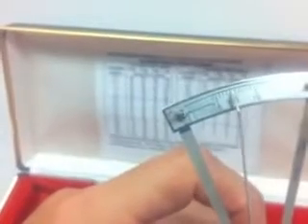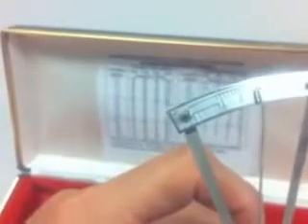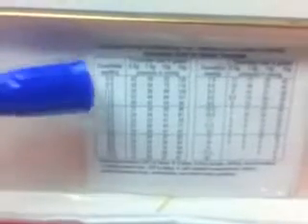And on this patient we get a reading of 5, and then what we do with that reading of 5, since we were using a 7.5 weight, you would say I have a tonometer reading of 5, and you look on the top for the tonometer weight of 7.5, and that correlates to an intraocular pressure of 26. And that is basically how you use the Schiotz tonometer.